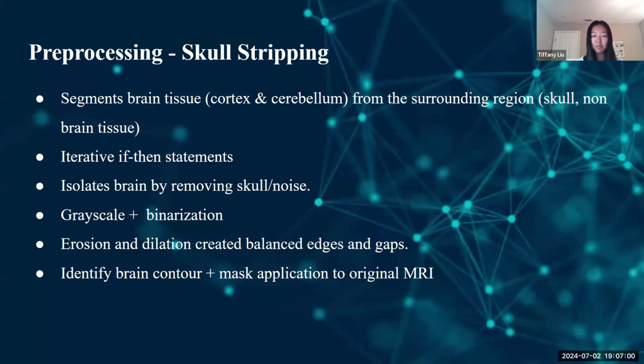We also have made improvements on the skull stripping to help it run on MRIs of different orientations, lower contrast and quality, and tumors at the edge of the brain. So the tumors on the edge are much greater in intensity than the brain, so when they're on the edge, the skull stripping originally segmented them out too, but after improving it, we were able to isolate them.